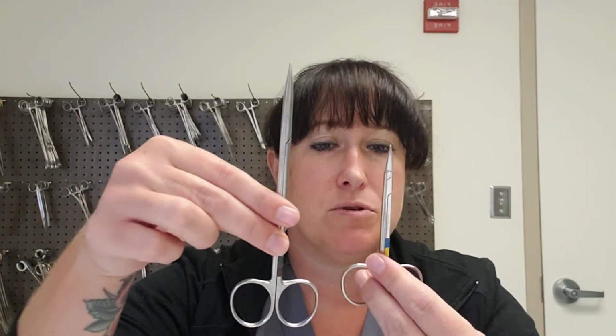There's these, which are really short and tiny. They're a little bit longer than the palm of my hand. I wear like a 6 glove, so that kind of gives you an idea. I'm sure you guys will figure out what gloves you wear. We'll work on that. But anyway, here's your Mets, which was pretty delicate, but look at this iris scissor compared to it. They're a lot shorter. The tip is not tapered like it is on the Mets. So, iris scissors. They're very small. Once again, delicate surgery.